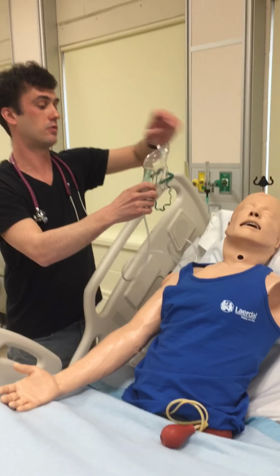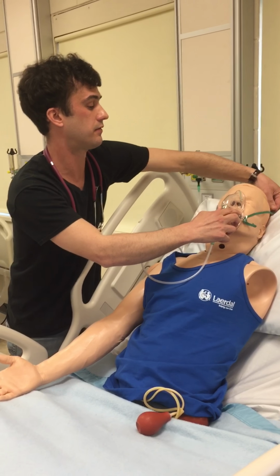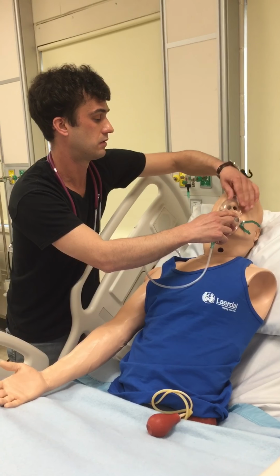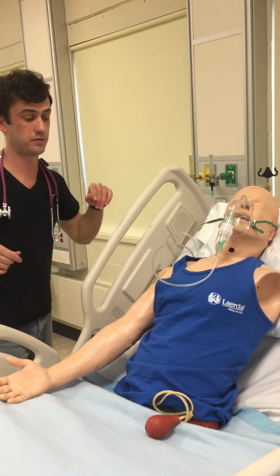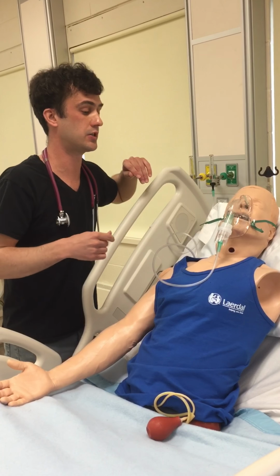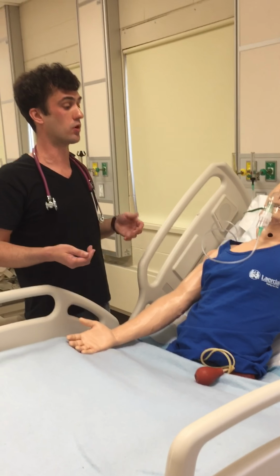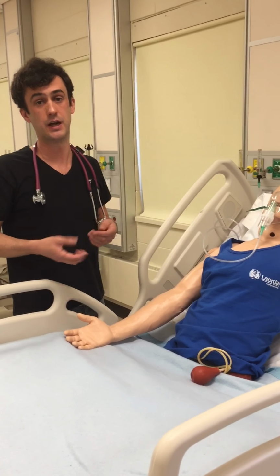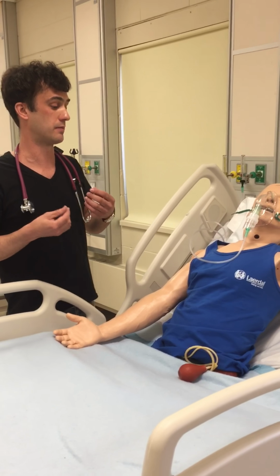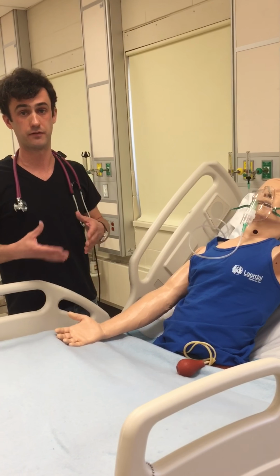I would then fit the mask on the patient, checking for fit and that the patient is comfortable. I would also coach the patient on how to breathe during the treatment, which is to just breathe normally with a few deeper breaths, and to hold in a few deep breaths, which will help the medicine deposit into the lower airways and will make the medicine work a little bit more efficiently.